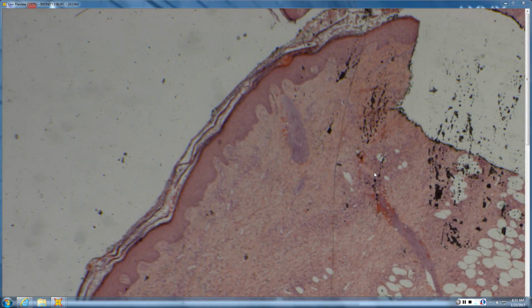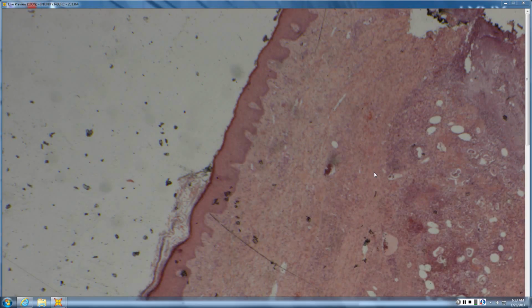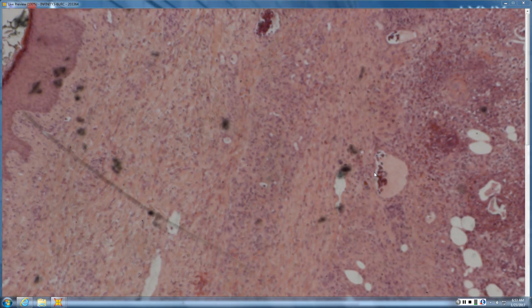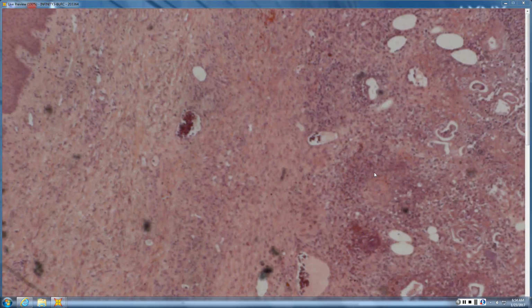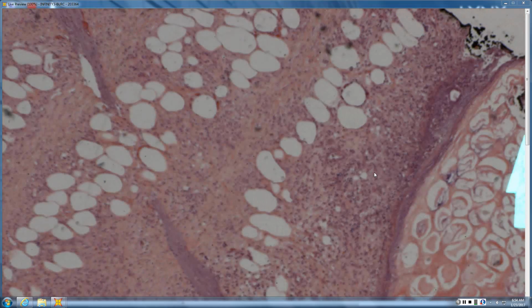But if you look here, here's the main process down here, the primary pathology, and you have this saponification and ghost cell change of the fat cells, which nothing else really looks like. If you have early pancreatic panniculitis, it can be a little more diagnostically challenging, but this case has more of the classic features. Sometimes you can get calcium deposition too, and necrosis. Here, these cells are all helpful, these guys. But probably the best cut is going to be here. So just burn that in your brain for pancreatic panniculitis.